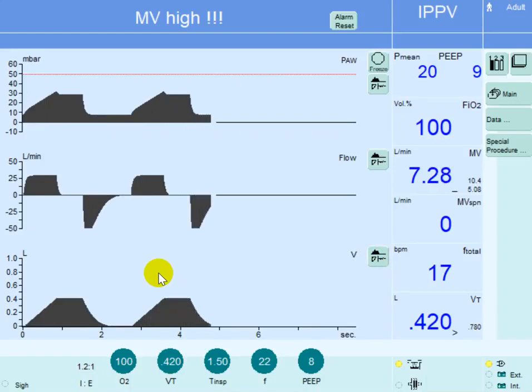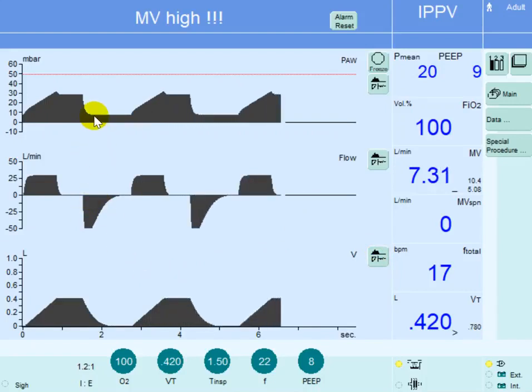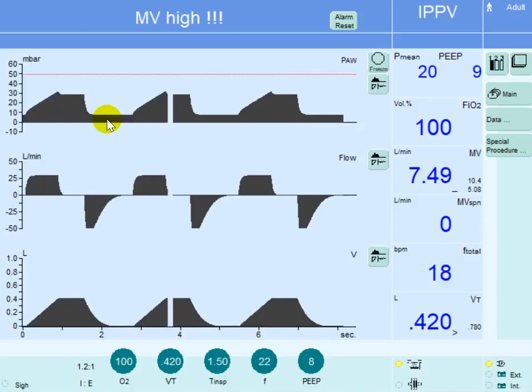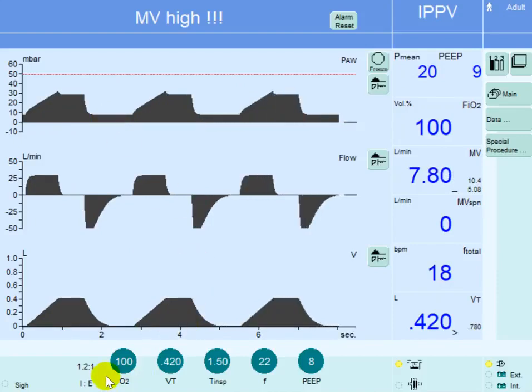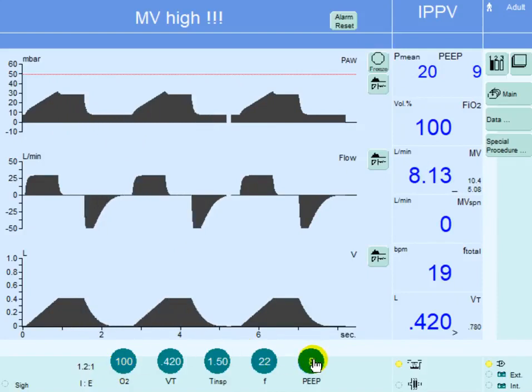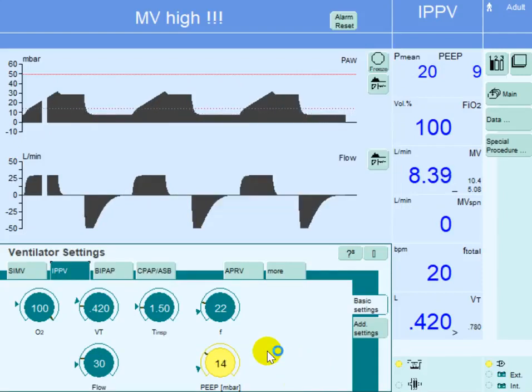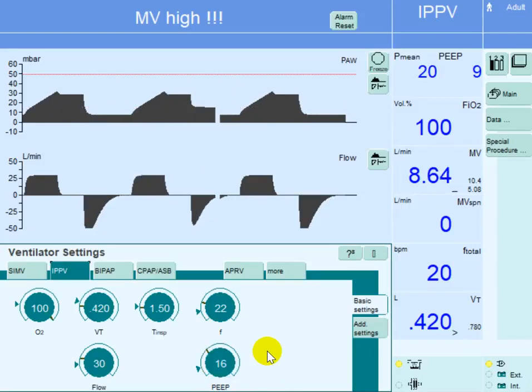The next step is to increase the PEEP. There are different ways to select appropriate PEEP, but here, given a FiO2 of 100%, PEEP should be at least 16 to 18. We gradually increase PEEP to 14 and then 16. PEEP is now at 16.